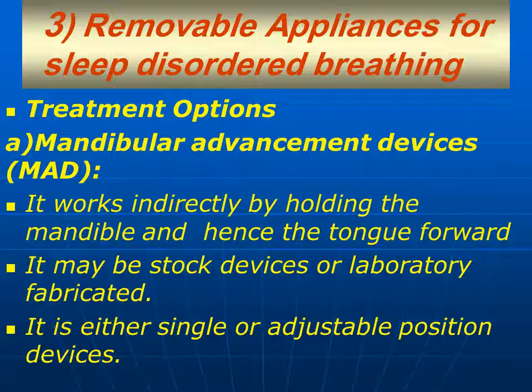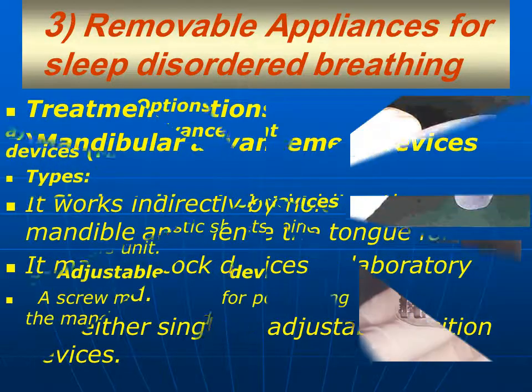It may be a stock device or prefabricated, as in ready-made appliances for sleep apnea, or we can fabricate it in the laboratory. These devices either have a single position or have adjustable positions, depending on the type.